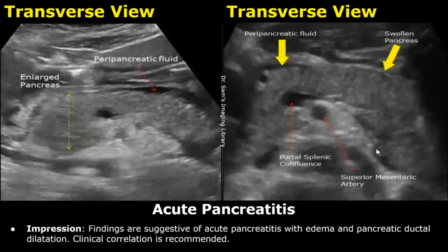And here is the impression. The findings are suggestive of acute pancreatitis with edema and pancreatic ductal dilatation. It is important to write clinical correlation is recommended because a diagnosis is not entirely done on ultrasound alone.